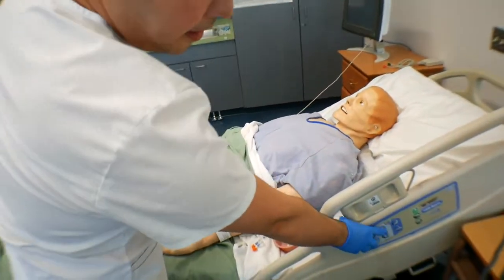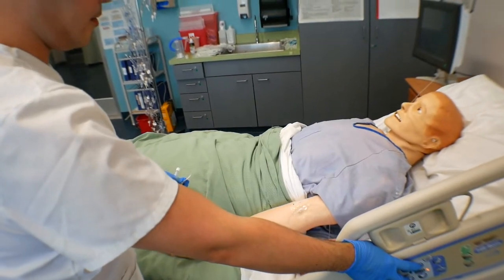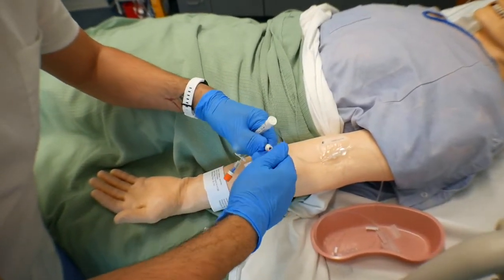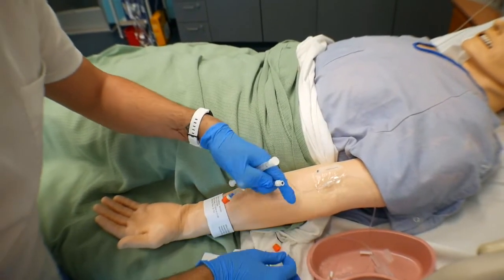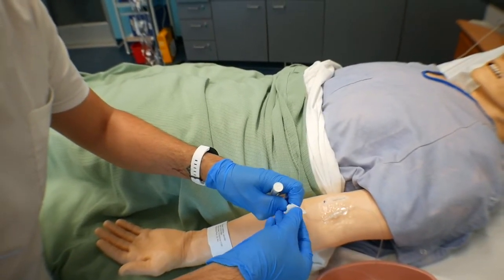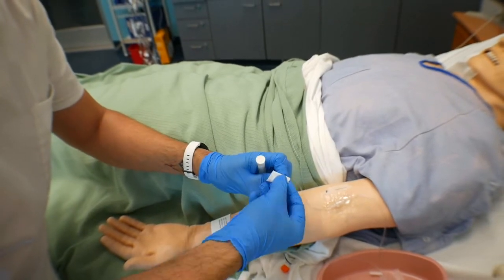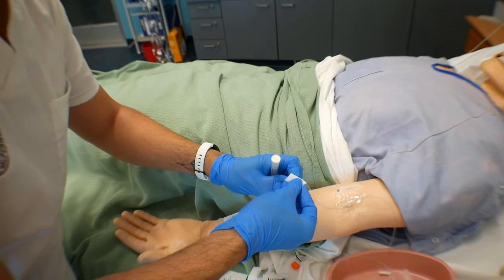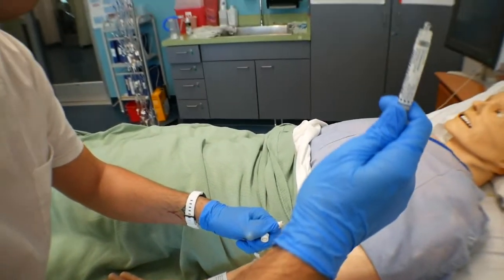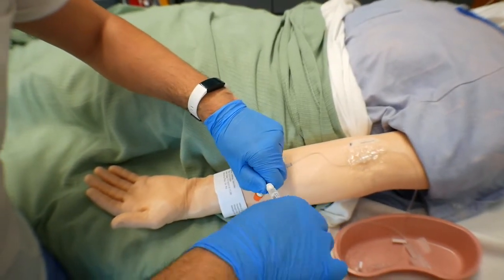Alright, so we're going to put the bed up. So we'll go ahead and wipe the white side for about 15 seconds. Make sure you have the friction. Alright. Okay, make sure there's no bubbles. You prime the 3 mils normal saline.